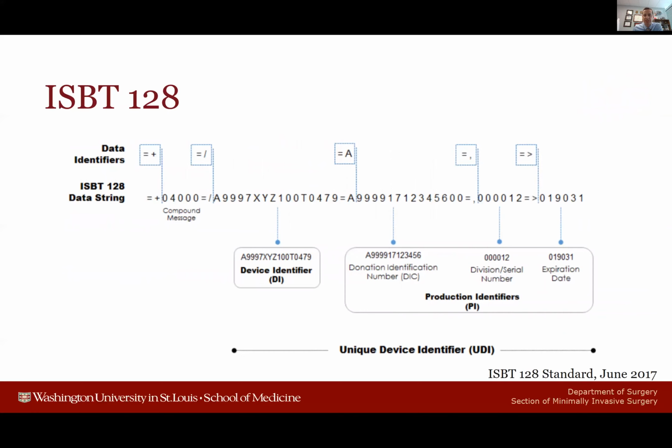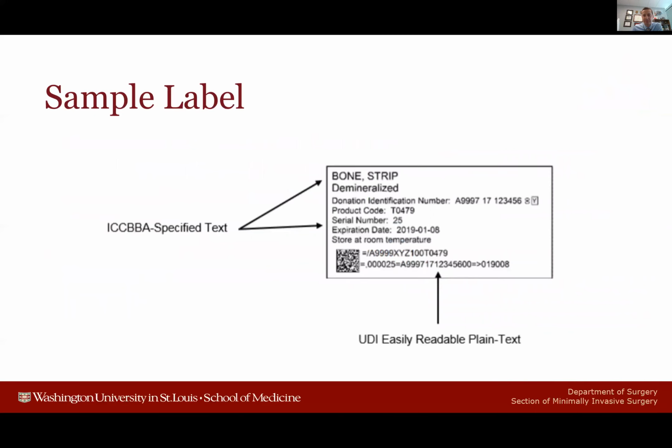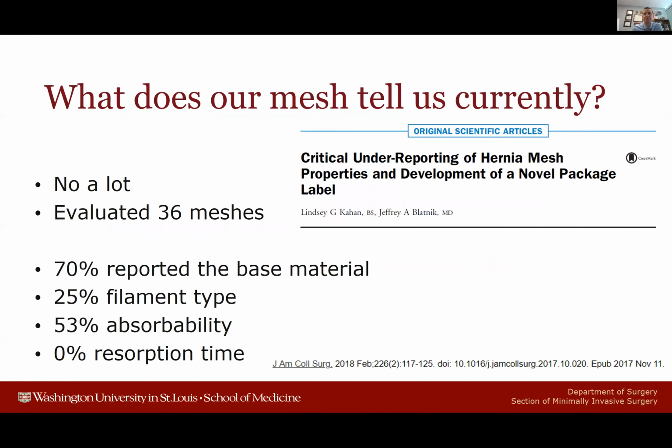Not to mention, it's a very complicated device identifier, including several numbers and letters along the way to identify the different parts, the serial number, the expiration date, but it really doesn't provide that much useful information for the end user, which is the surgeons like us who implant or use these products on a day-to-day basis. So even though it did give you some basic information, it really doesn't give you a lot of useful information about the specifics of that mesh that you plan to use at that time.